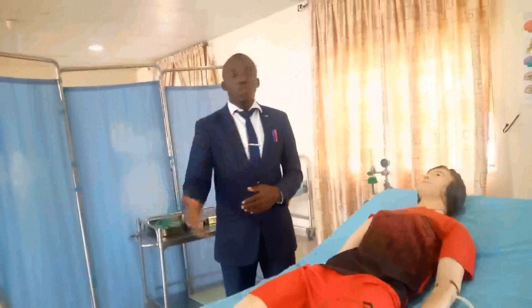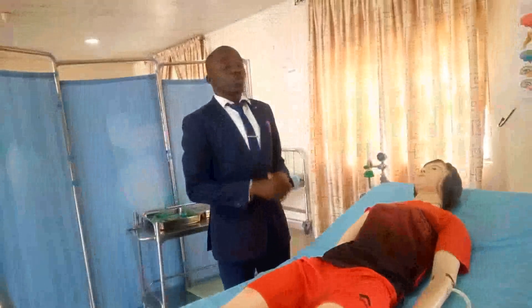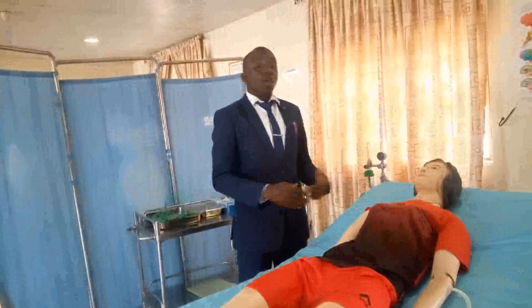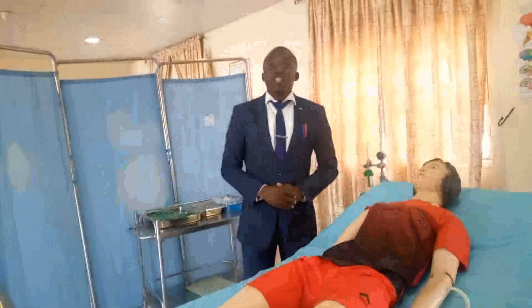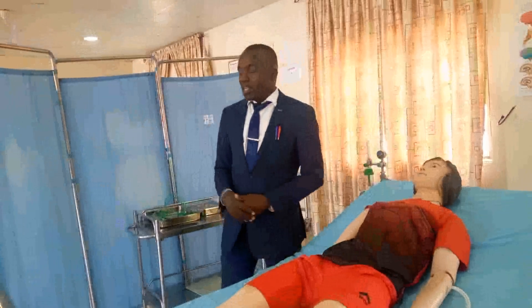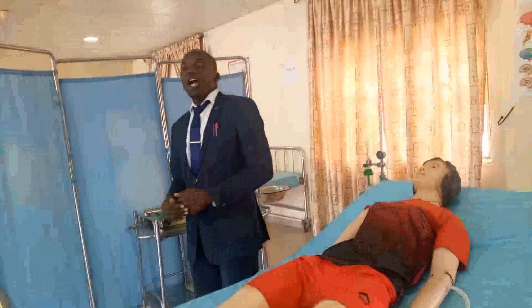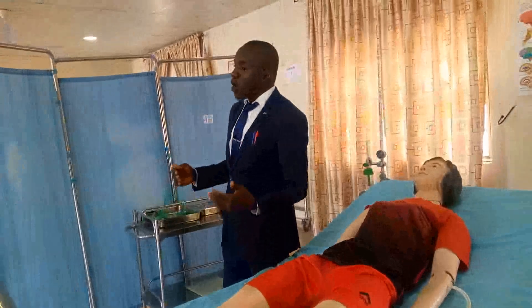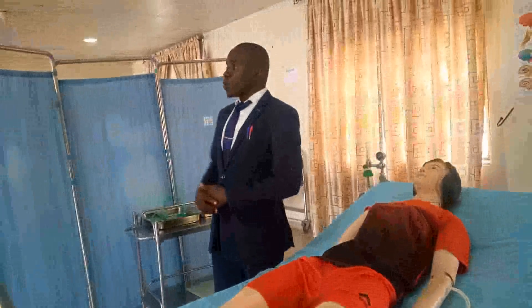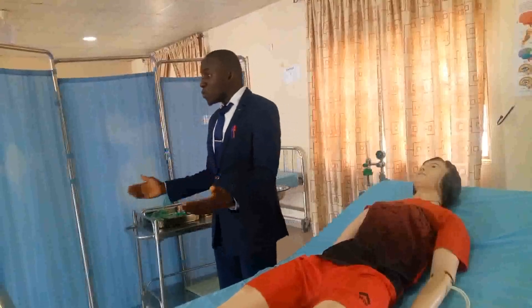Greet them, introduce yourself, explain the procedure, and obtain consent. My patient is unconscious, so I am introducing myself to the patient's relations: 'Good morning, I am Nassali Wu. I am here to administer oxygen to your patient using a face mask so as to aid in his breathing. Can I go ahead and perform the procedure?'